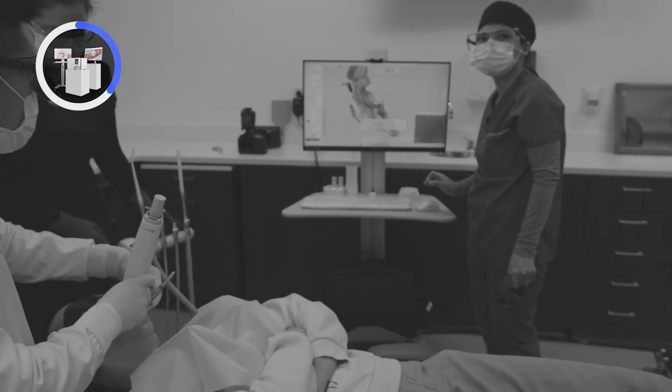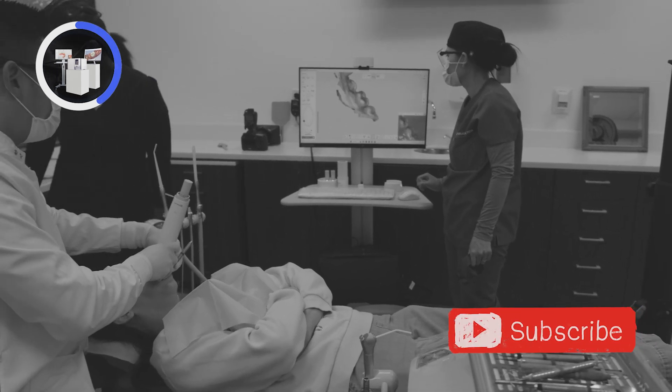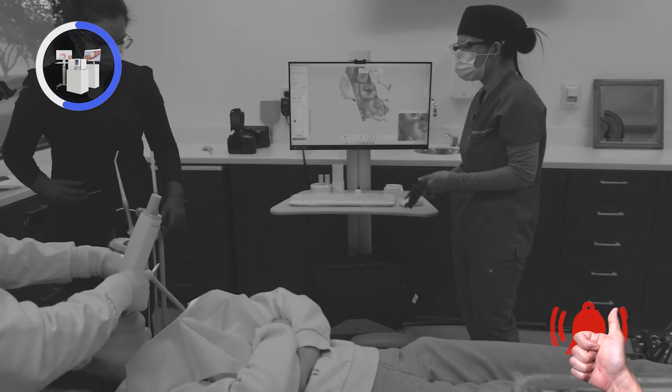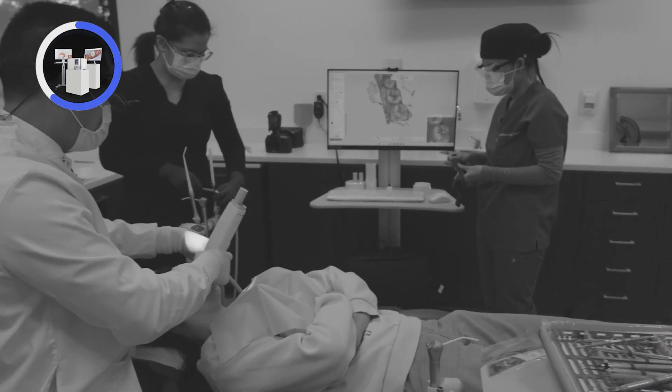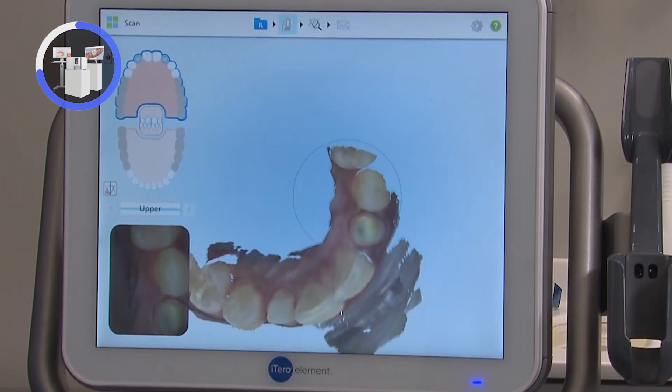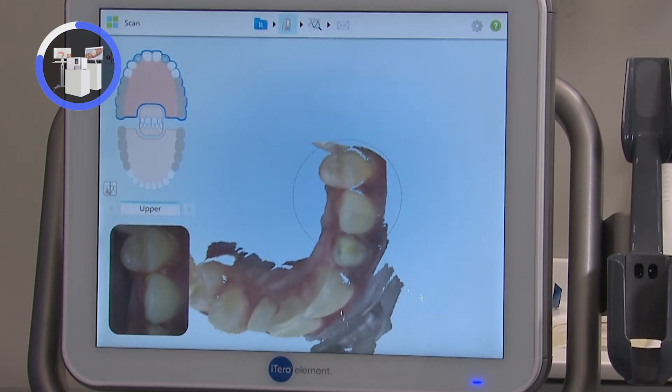Taking impressions with a digital scanner is an active process where you sweep the scanner along all of the surfaces of the teeth while observing the model that's generating on the screen. After each set, it's important to analyze the model to ensure the necessary areas have been captured.